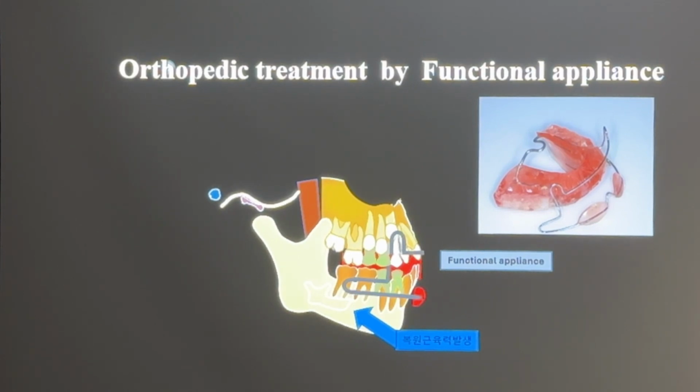And then next, these lower anterior teeth will intrude because of this force. So we can control the curve of Spee. The basic rule is please don't make any selective grinding at the incisal edge.